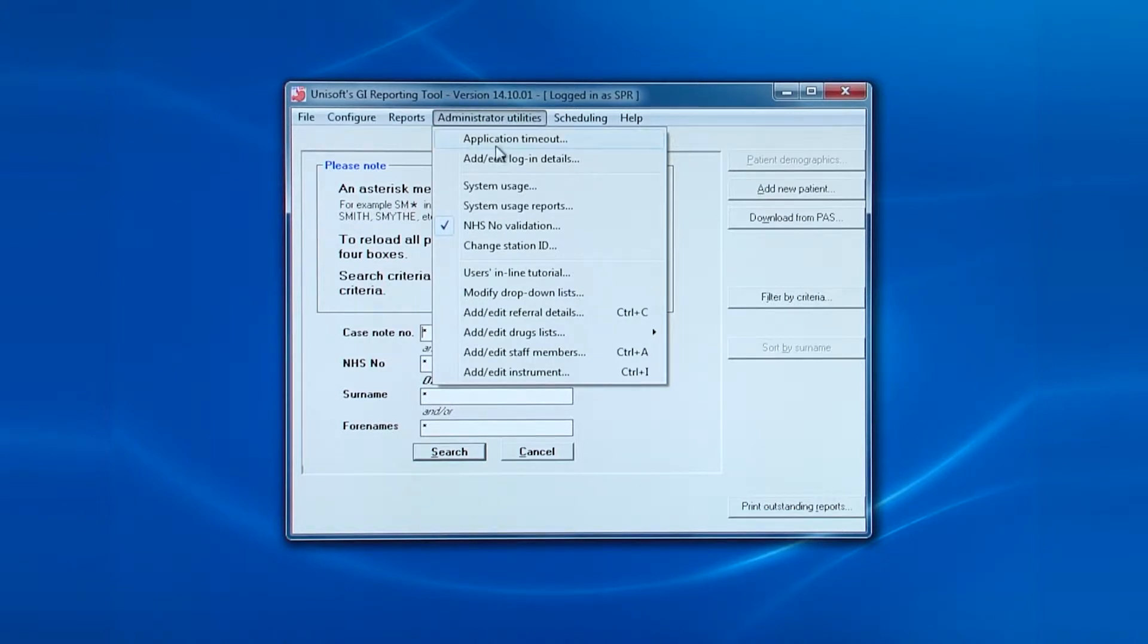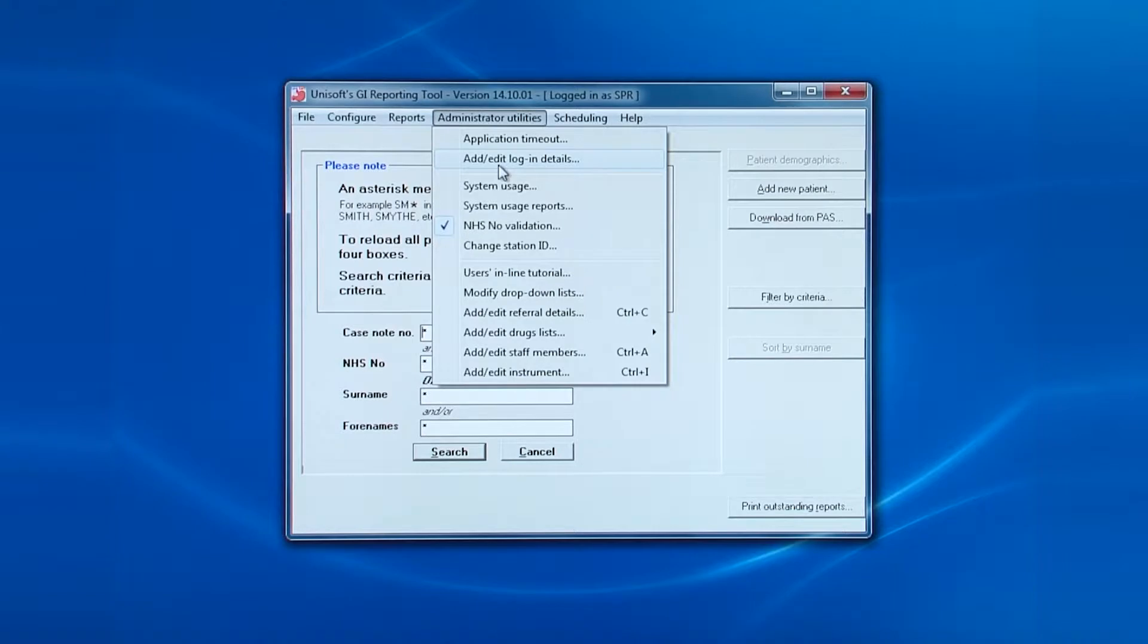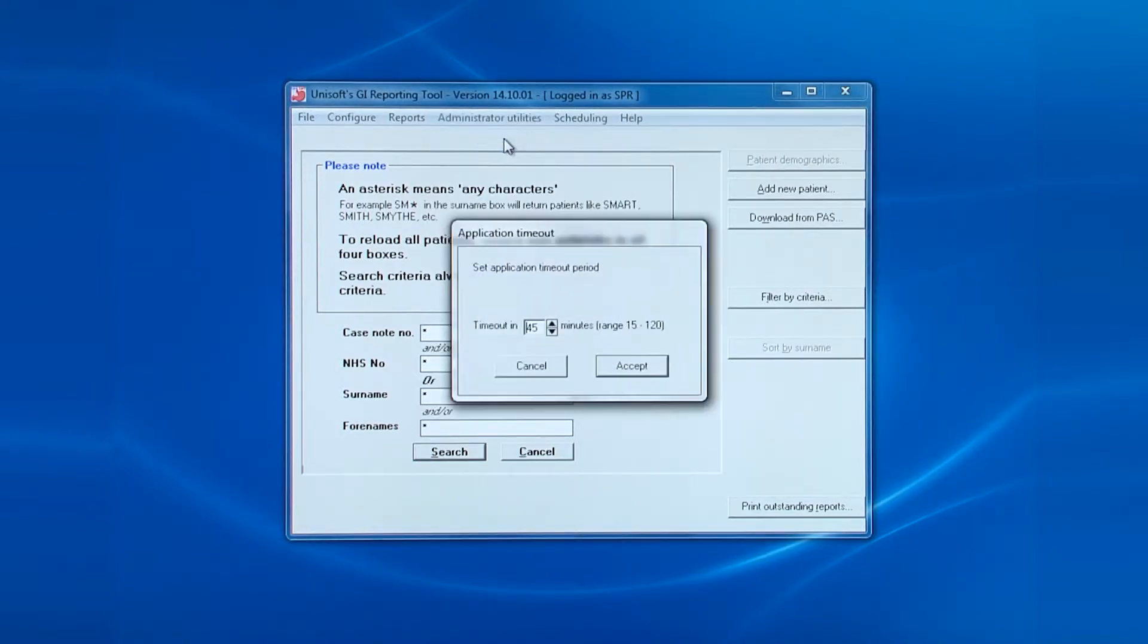These are the entries for the administrator utilities. The first entry allows you to set the software timeout for the particular PC. What this means is that if there has been no activity when the software is left at the opening screen, the software will automatically log that person out.